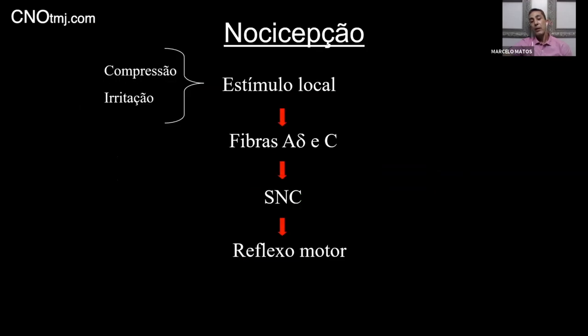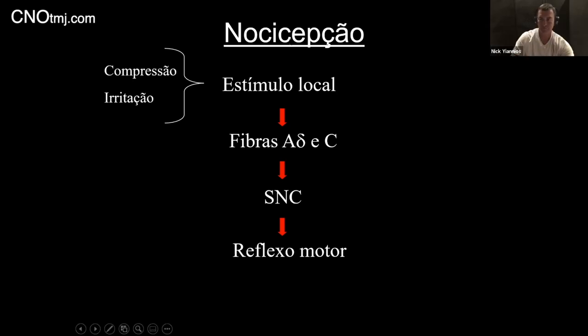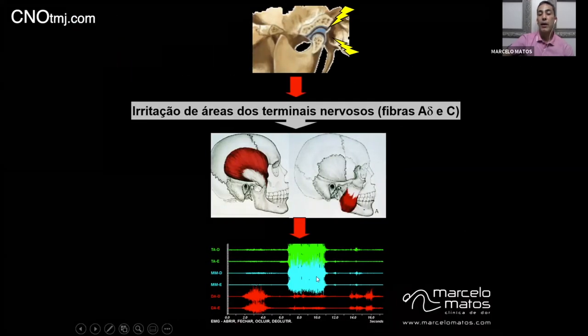That's where the understanding of how it is in Portuguese. So if someone here understands a little bit of Portuguese, I'm from Brazil, Brazil speaks Portuguese, but people who speak Spanish may also have some understanding of Portuguese. So here we have nociception. It's a very similar word as in English. Thinking about compression or any kind of irritation, a nociceptive stimulus in terms of local aspect, the joint itself. It's going to take the A delta and C fibers, bringing the input to the central nervous system and getting back the reflex through the motor system. There is where the EMG jumps in.